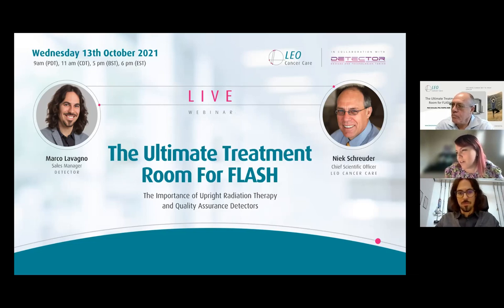What is limiting the, I'm guessing, 1 kilohertz DAQ rate? Is that right? Are there plans to push to even higher DAQ rates? The 1 kilohertz DAQ rate is mostly related to QA systems. This is something that we established as a limit, even if it's not a limit of the electronic and of the system. As I said before, we can have a response even better than one megahertz in terms of electronic response, so it can be pushed to a higher DAQ rate, of course. This is a setup we established for the beam QA systems and for our catalog products. Then, of course, the customization and also the flash therapy developments may lead to a different setup.